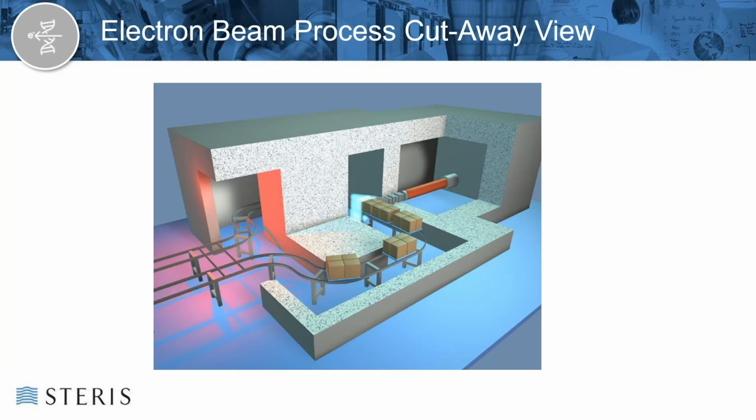As you can see from this picture, we have a certain flow through our acceleration of electrons process, or e-beam process. The product is flowing from the lower left through the process. It's a one-way path, and it's coming out again in the lower left. This process, as you see it here, is providing for one-sided irradiation, at least as far as what you see immediately visible.